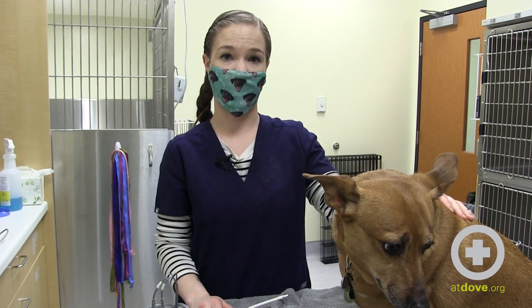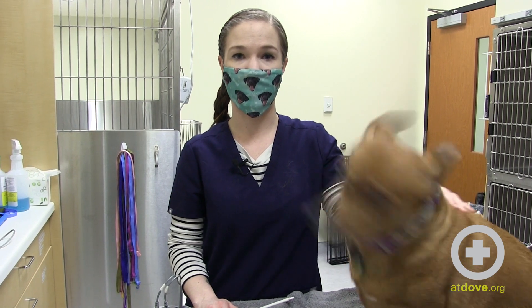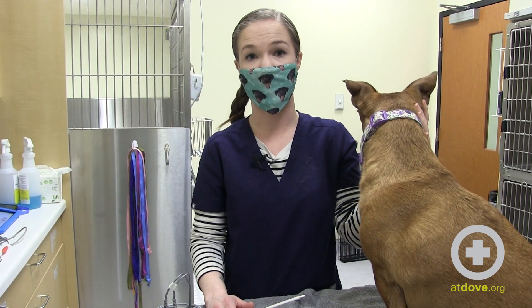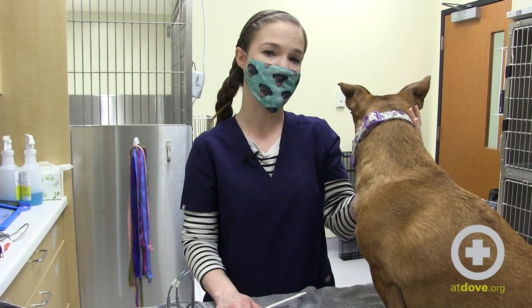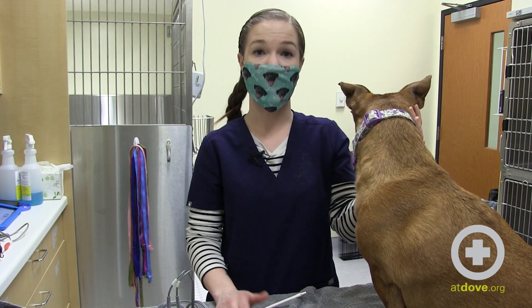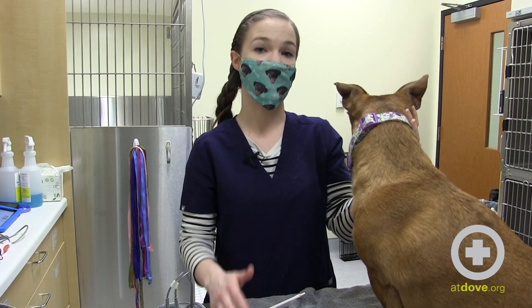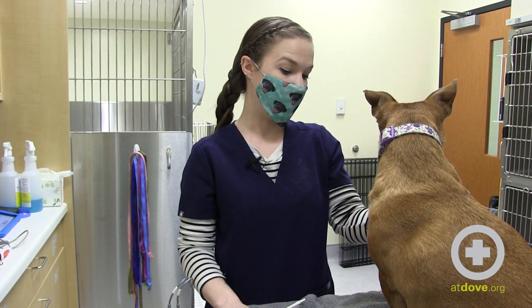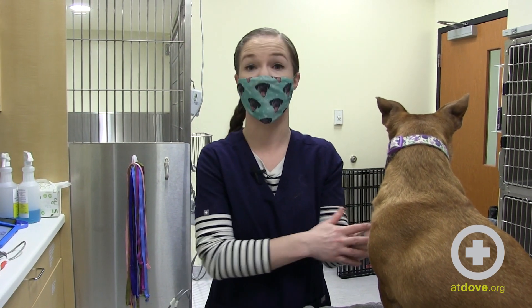Another thing that can give you a falsely elevated pressure is her posture and how we have her. Sitting and standing — some studies have shown that can give you up to a 25-point difference in your blood pressure, which can actually cause a false hypertension in your patients. So ideally, lateral is the best. If you are taking it sitting or standing, notate that in the chart so we know it may be slightly higher than it actually is, but we can also be consistent with those readings. You'll see this a lot with tall patients like Great Danes or Irish Wolfhounds. And it also happens a lot with shorter, squattier patients — Frenchies, Basset Hounds, Dachshunds — that don't have a lot of real estate to work with.